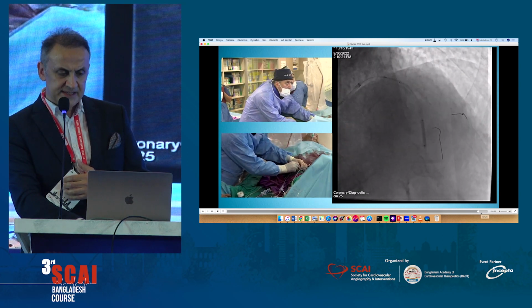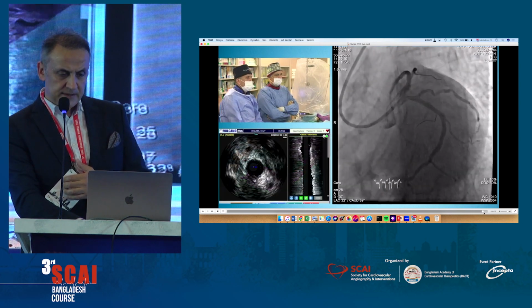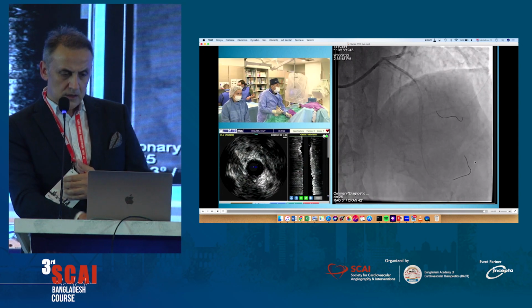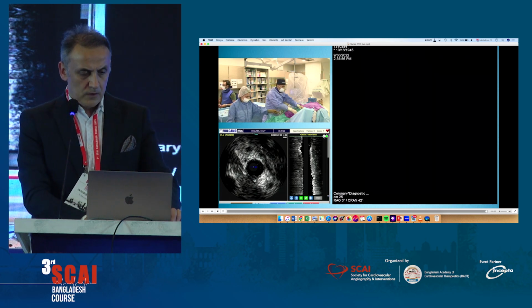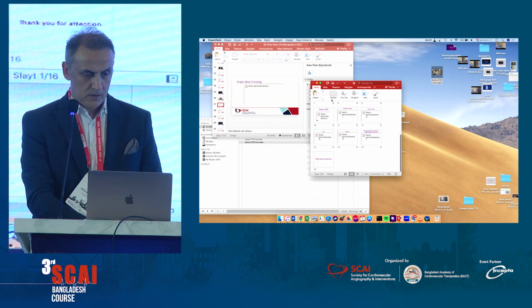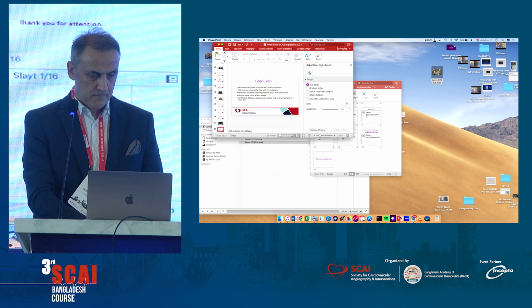Distally, we did some drug-eluting ballooning, and this is the final result. I will show very good expansion as well. So, I think in conclusion, retrograde is important, very complementary. We should know how to do it.